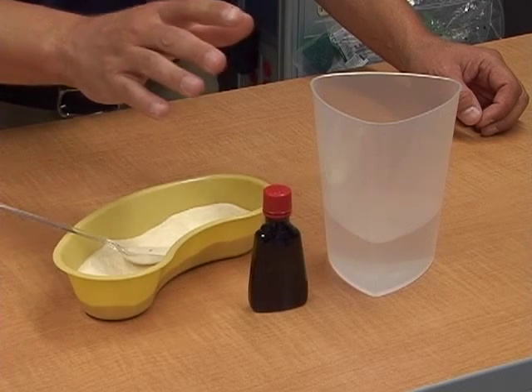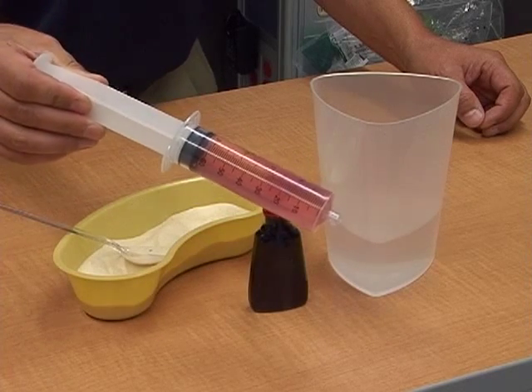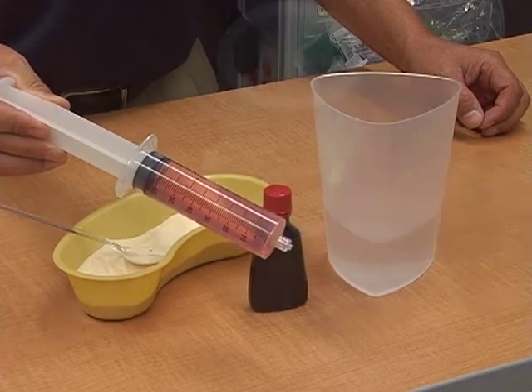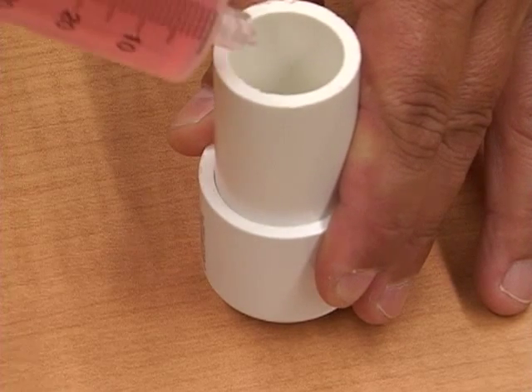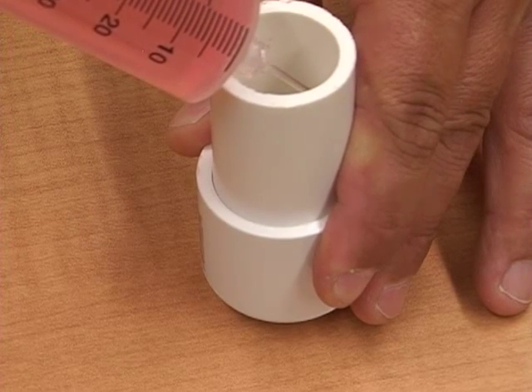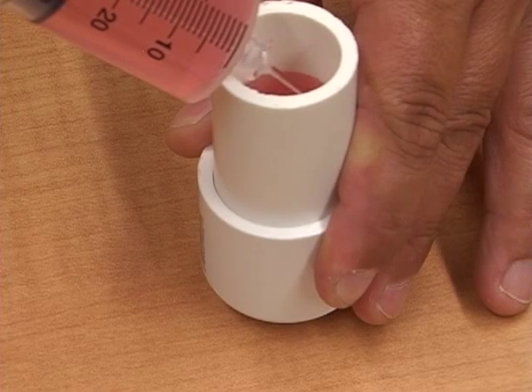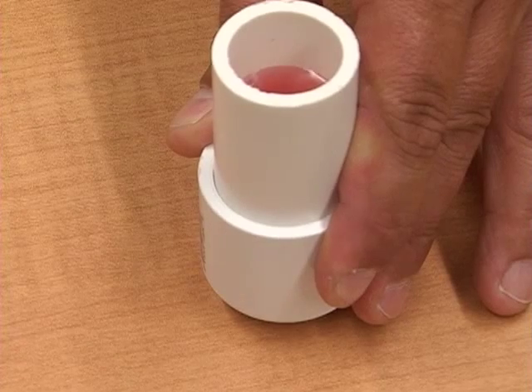Once everything's mixed up real well, take a large syringe and draw it into your syringe so you have a nice controllable way of getting your gelatin into your cervical and uterine model. Now it's time to fill up your uterine model. Take your gelatin-filled syringe and fill up your model to about three-quarters the height — usually takes about 40 mLs. Once you've got that, put it in the refrigerator and let it cool.